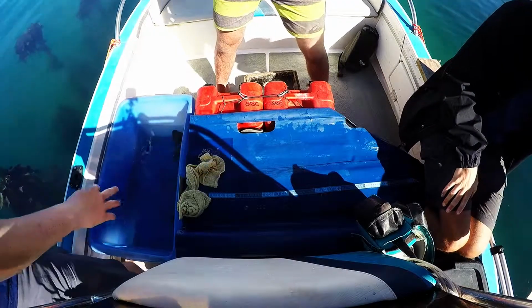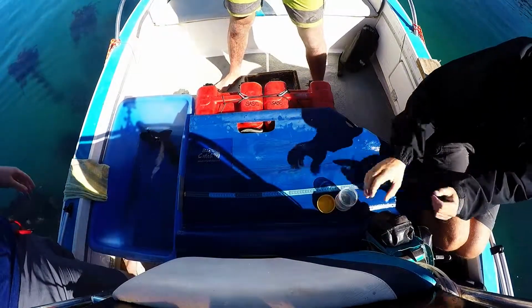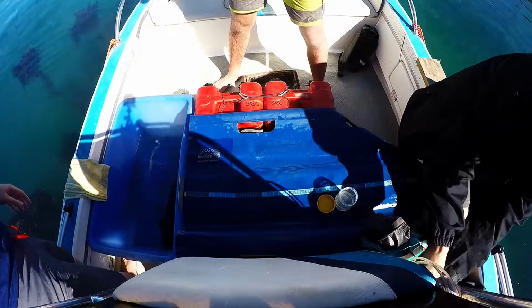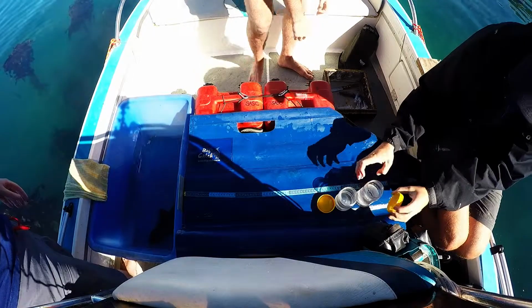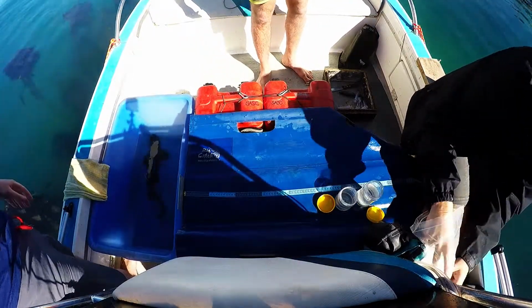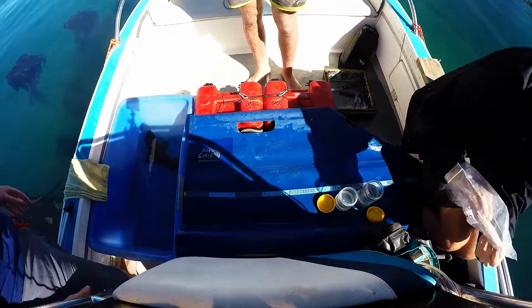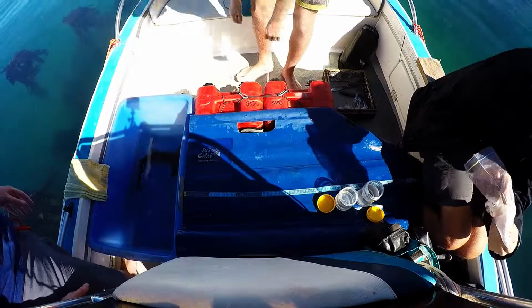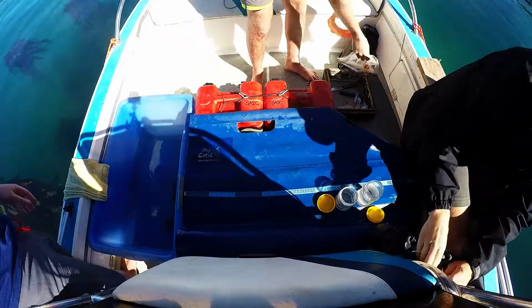Between measurement sets, the shark should be placed back into a tub of fresh seawater to minimize air exposure time. With the shark back in the water, preparation can begin for the next set of measurements. Ethanol is used to sterilize all instruments, which are then rinsed with distilled water, as ethanol can burn the skin of the sharks. It is important not to rush and to be organized and prepared properly for your next set of measurements.